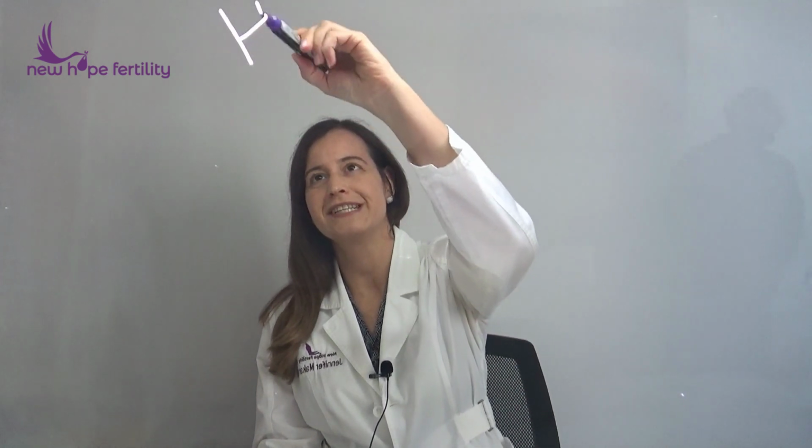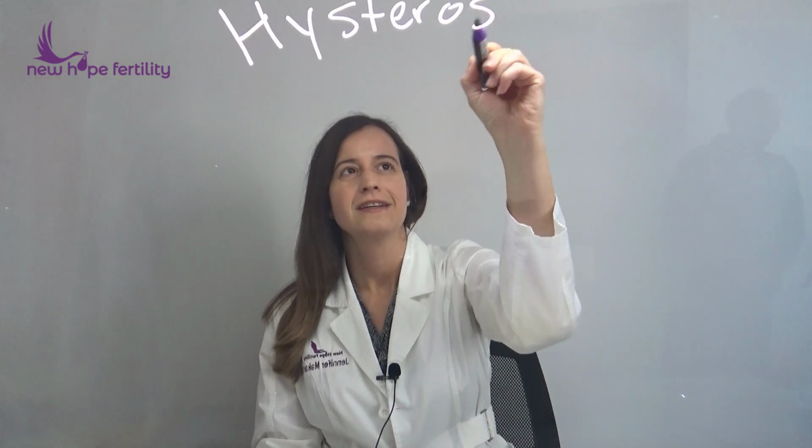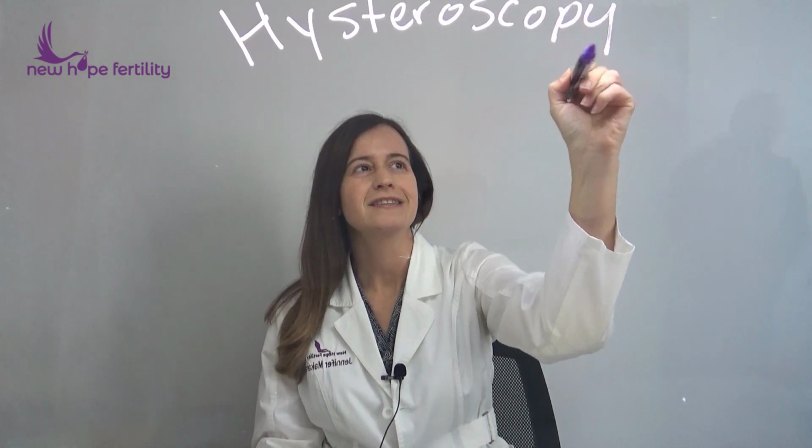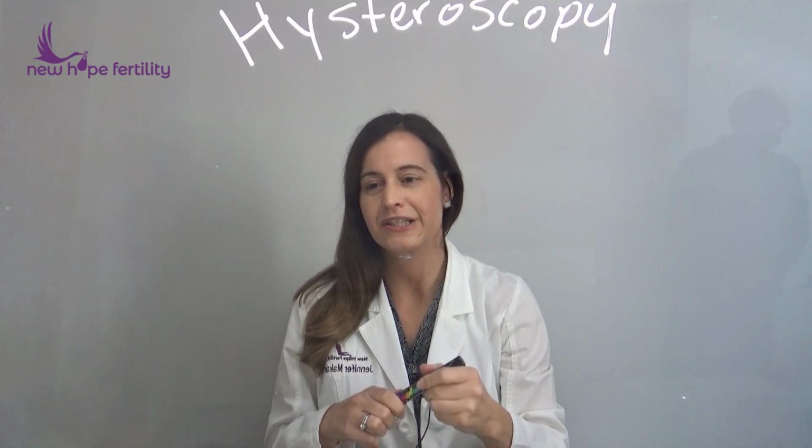So what is hysteroscopy and why do you need to do it? Okay, so hysteroscopy means putting a camera through the cervix into the uterus.